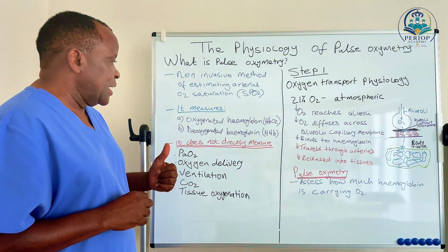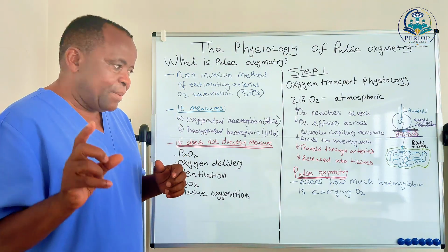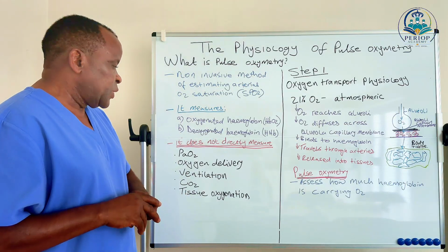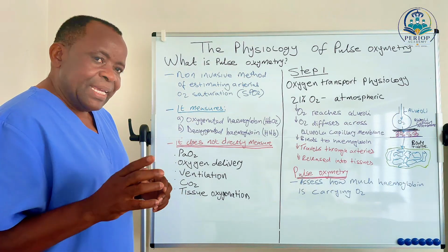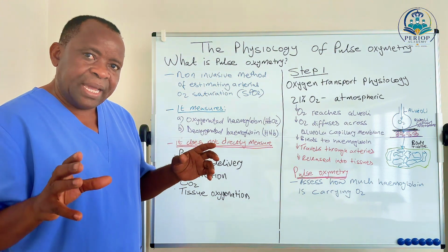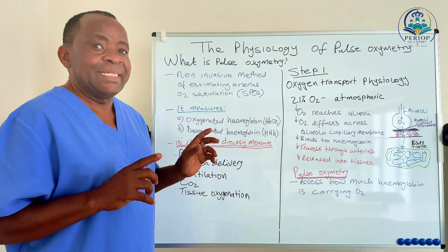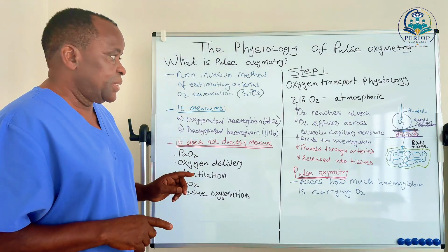However, it does not directly measure the oxygen partial pressure, oxygen delivery, ventilation, carbon dioxide, and tissue oxygenation. It doesn't directly measure those.